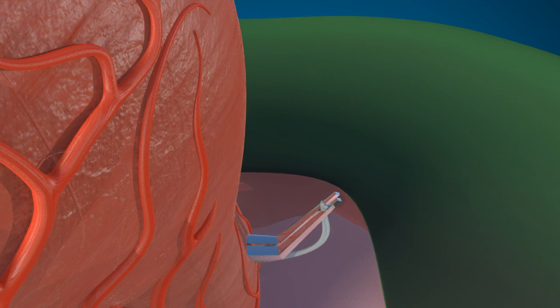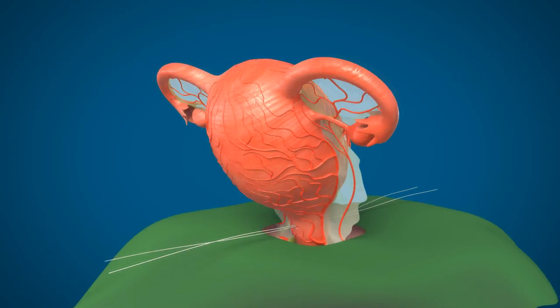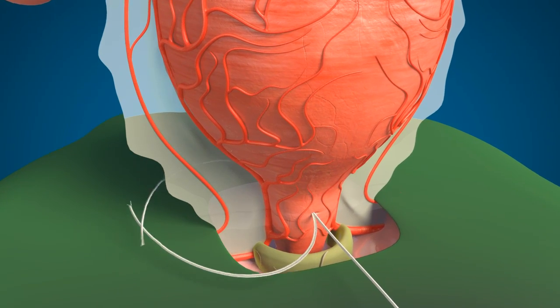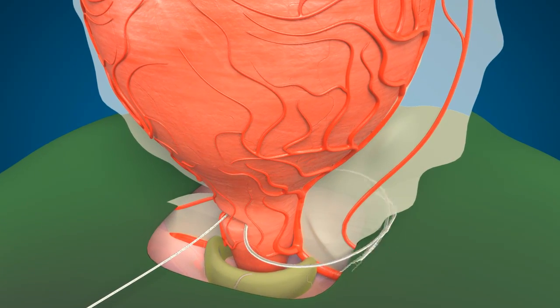The tip of the forceps is opened and the threads are pulled out and the forceps is taken back. One thread is taken to the right side and the other to the left side, and tied on either side as low as possible and as tight as possible.